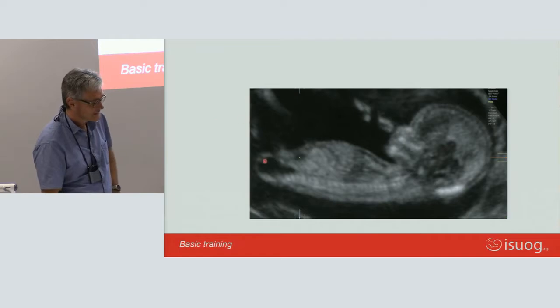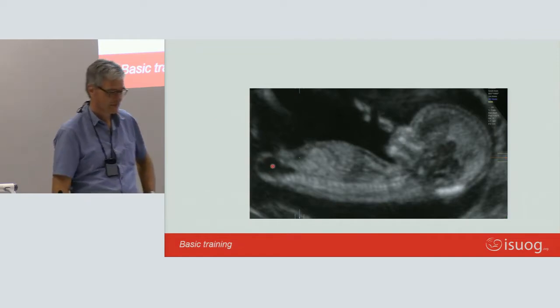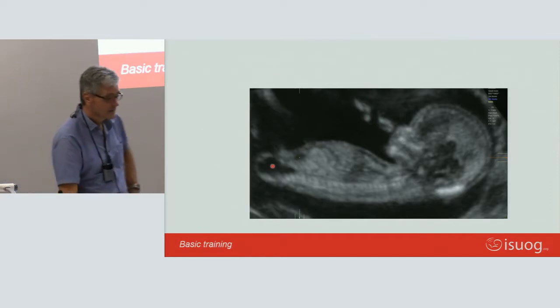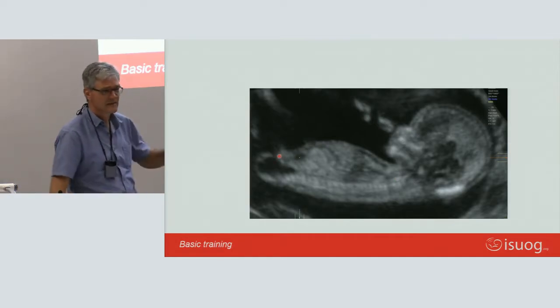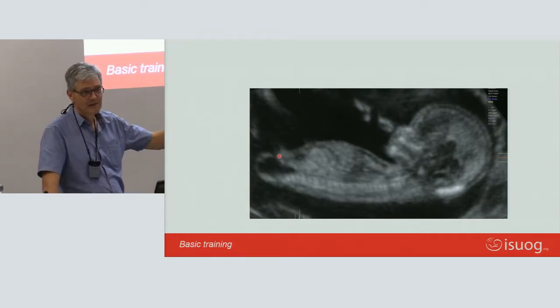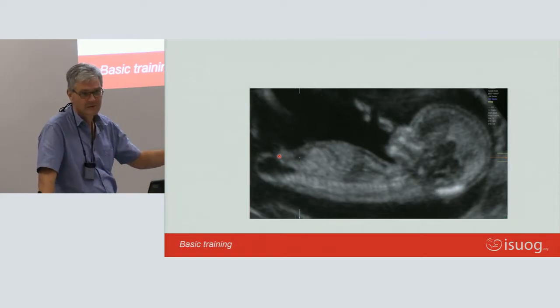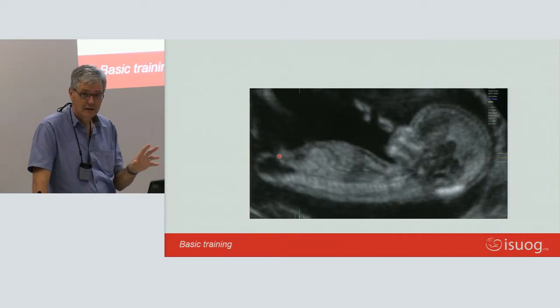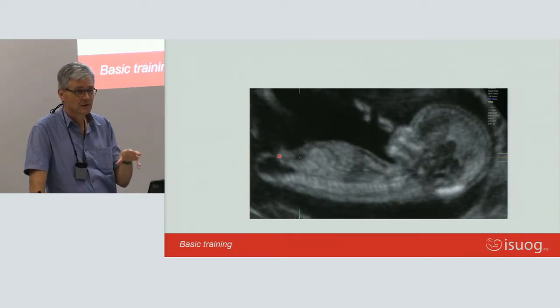Well, it's got something here at the bottom of the spine. Okay. And of course, now the first thing is some kind of cyst at the bottom of the spine. What's the first thing you think of? Spina bifida, of course. There's a spina bifida, a cystic lump at the back of the spine, and often the diagnosis would be a bit like chess.